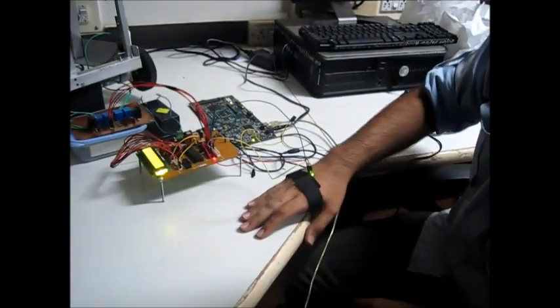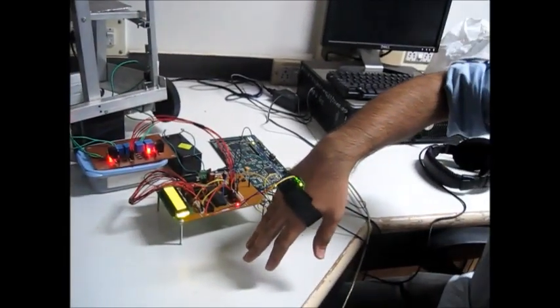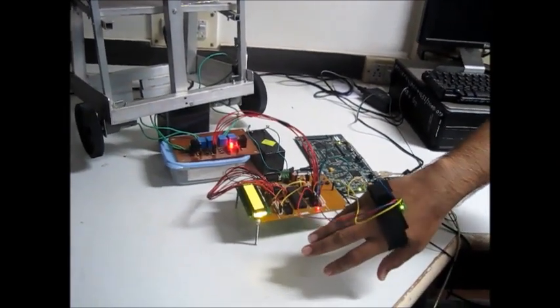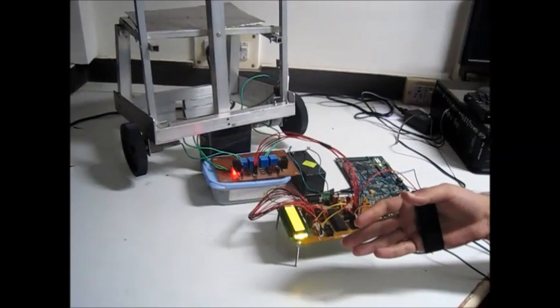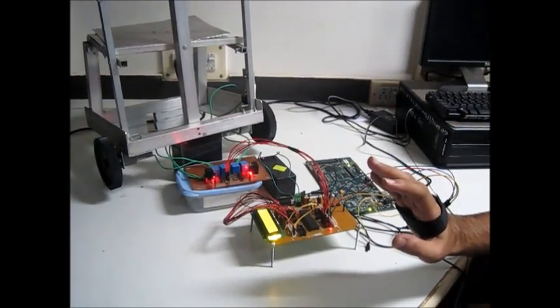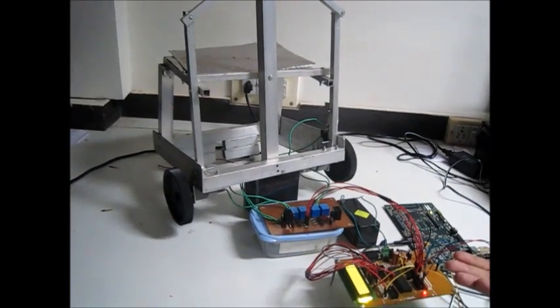To move the wheelchair in the forward direction, you move your hand forward. Now to take a left turn, you tilt your hand in the left direction. To take a right turn, you tilt your hand in the right direction. To move backwards, you tilt your hand towards yourself. In order to stop the wheelchair, you just tilt your hand upside down and the wheelchair stops. This was the demo for the wheelchair controlled using an accelerometer.